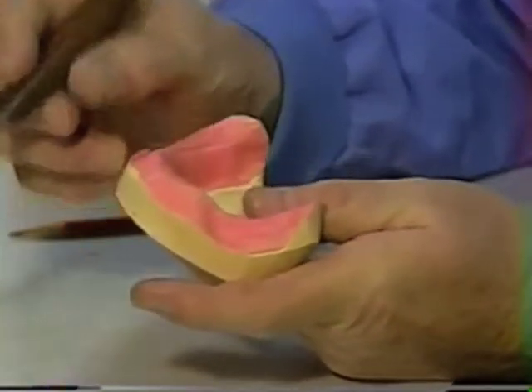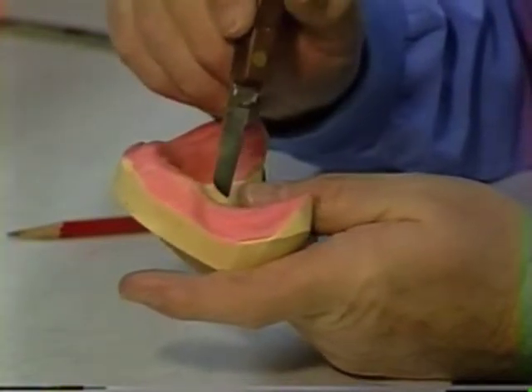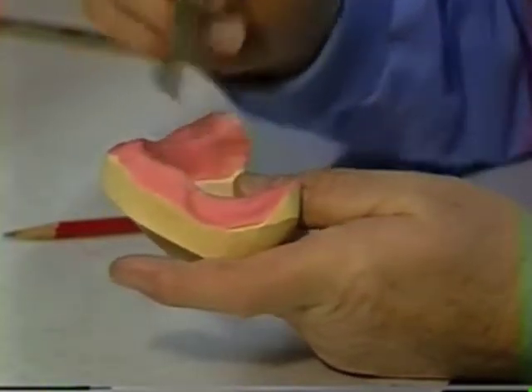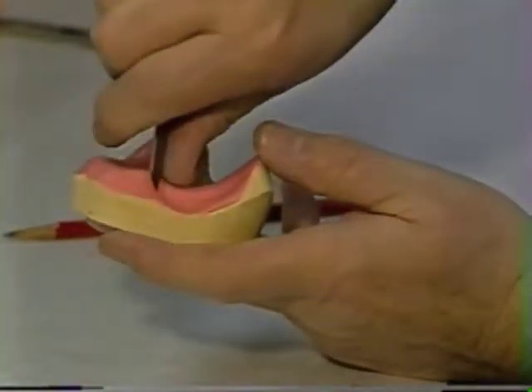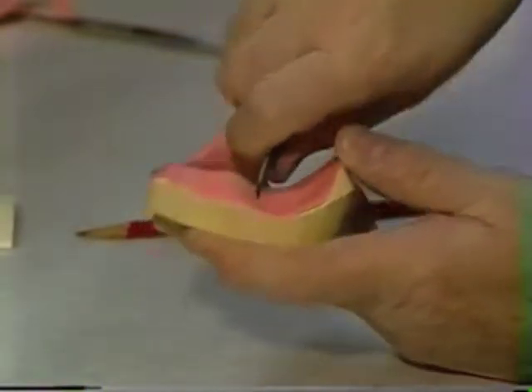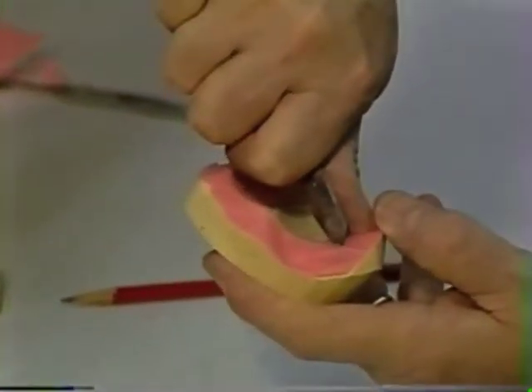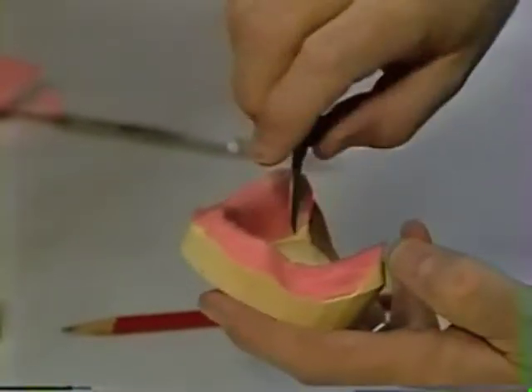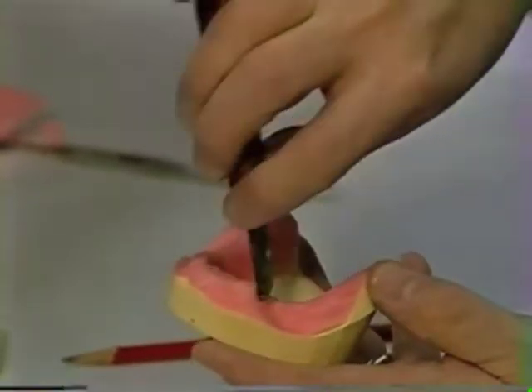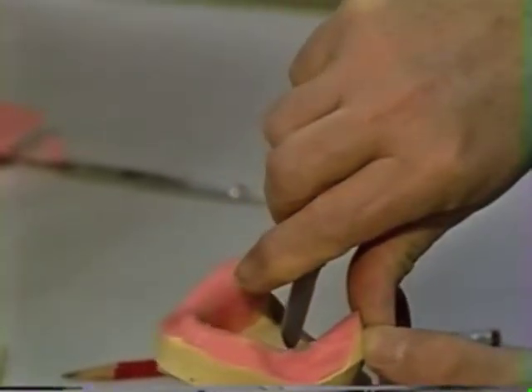The problem I find with people cutting the stops into the wax is they make it too small, and that's worse than no stop at all. So let's go ahead and put a stop into it, and when you put a stop into it, you make it cover all of that buccal shelf area, which means everything mesial to the retromolar pad and all the way up to the buccal notch where the buccal frenum would be, and from the crest of the ridge out.